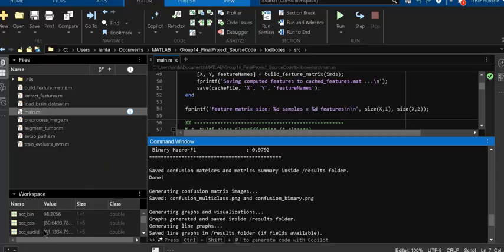For the future work, we would like to add PCA based feature reduction, explore morphological segmentation, and improve and compare the KNN against other classifiers such as SVM. If toolboxes are allowed, we could also benchmark against the CNN for comparisons.